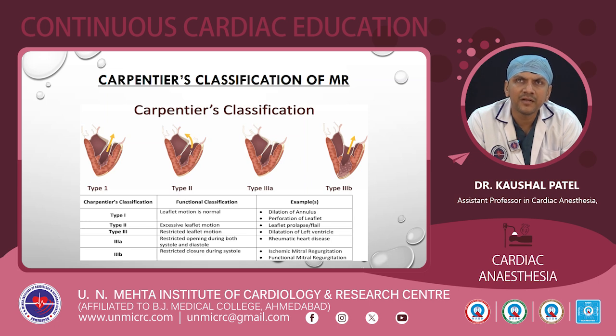So papillary muscle displacement and regional akinetic motion, regional akinesia, can lead to ischemic mitral regurgitation. That is a restricted closure during systole, because during LV systole the closure is not appropriate at the coaptation point, and the shifting of the coaptation point towards the LV side can cause ischemic mitral regurgitation.